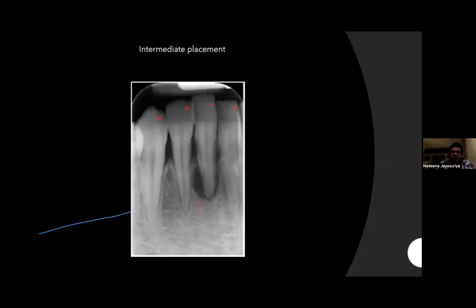So this is what I told you. If there's a periapical infection, you run a risk of the implant getting infected if you put the implant in directly. But when you get more skills, you will understand you can clean this and then put the implant in safely. But remember, there is a slightly higher risk of failure if you don't do the proper technique.